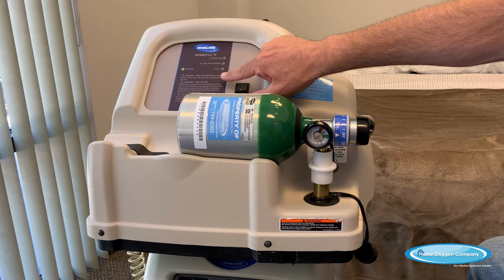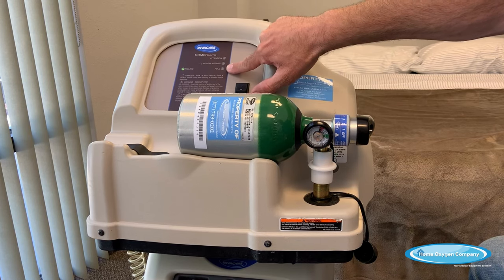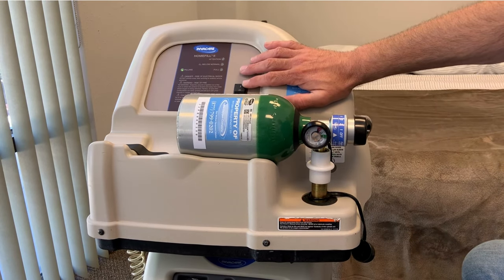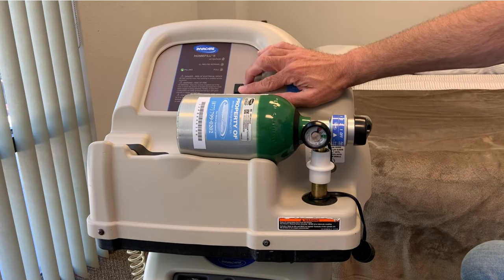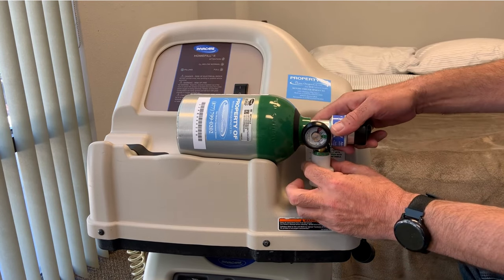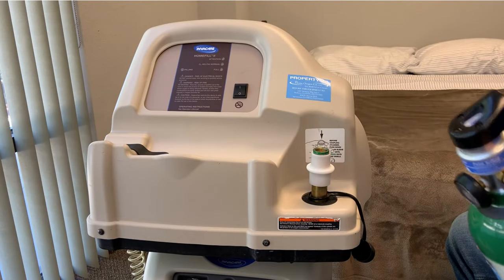Once the filling process is complete, you'll see the full light — this is also a green light. This full green light will light up and the machine will automatically stop filling. At that point, if you are finished filling your tank and your full light has come on, turn the compressor off. Then pull down on this white coupler, pull up on the tank, and remove it.